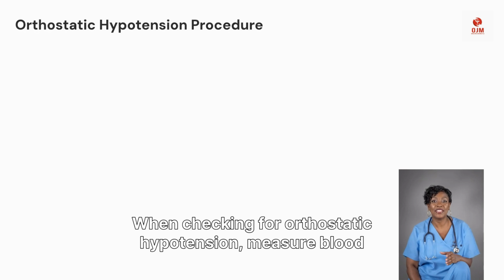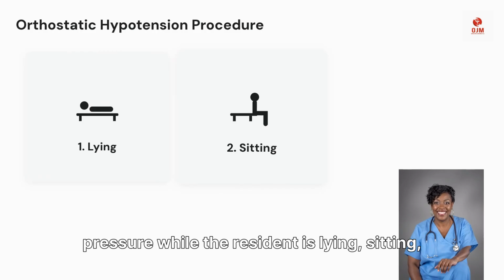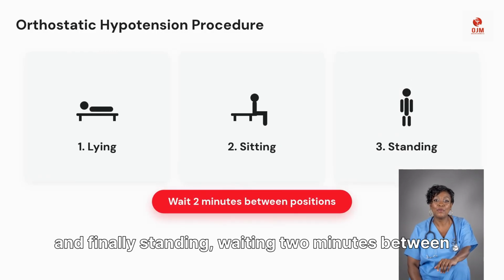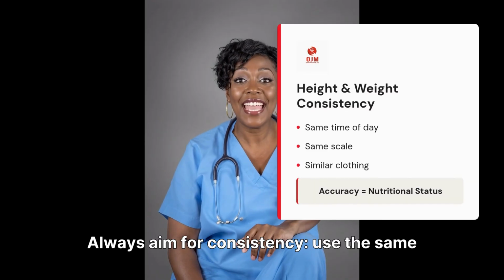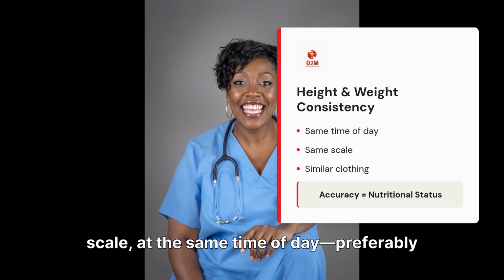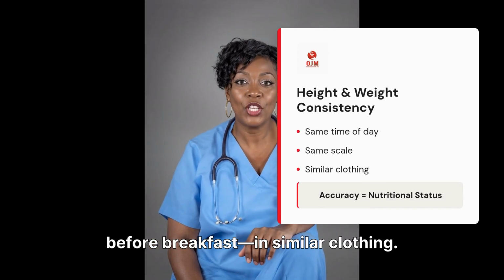When checking for orthostatic hypotension, measure blood pressure while the resident is lying, sitting, and finally standing, waiting 2 minutes between each position. Height and weight reflect a resident's nutritional status. Always aim for consistency. Use the same scale at the same time of day, preferably before breakfast, in similar clothing.